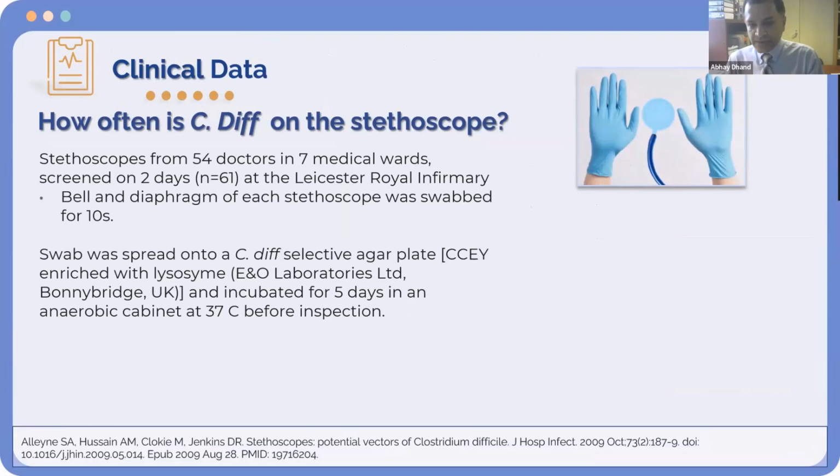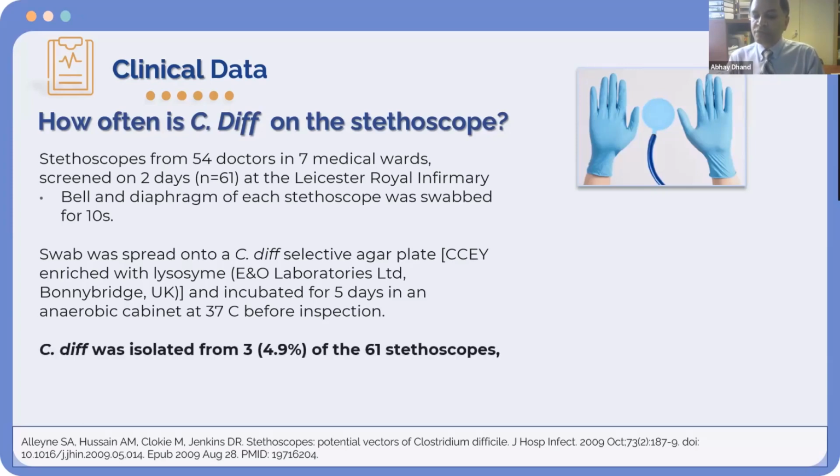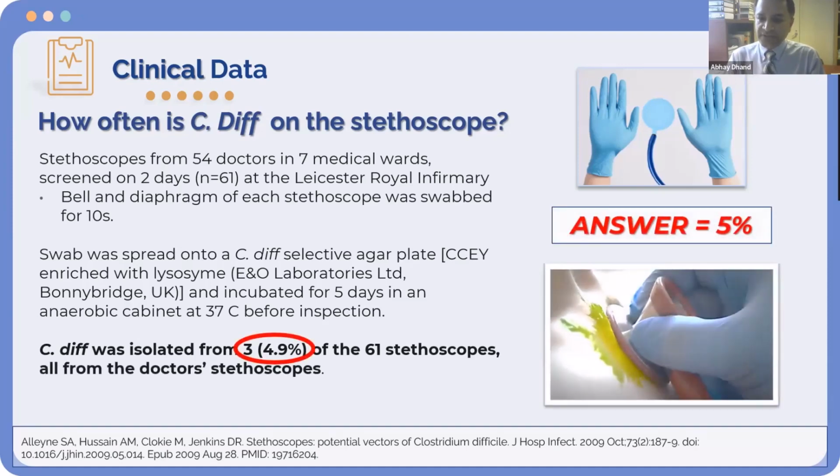It was done in England, in which 54 doctors in different wards had their stethoscopes screened over consecutive days, and the culture was done in a specific way to promote the growth of C. diff. What was shown in this study was that up to 5% of the stethoscopes were at risk of taking the C. diff from one patient to another patient. So that risk is substantial.